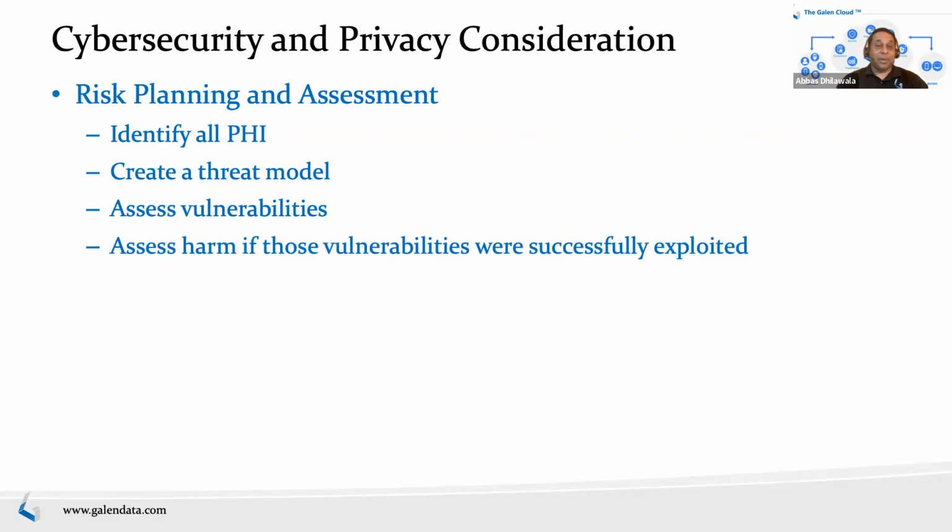And then you assess harm. What happens if those vulnerabilities are exploited? What's the harm to the patient? Again, very similar to safety risk, same process, same general risk assessment, and then assign a probability of such an event happening. Now the probability is only for priority. Probability shouldn't be used to completely discard those risks. It's just to identify what you should address first. Obviously, there are limited resources. Nobody has unlimited time and money. So there are always going to be certain risks that you accept, and you have to do your risk-benefit analysis at the end, just like you do with your safety risk. You do that with cybersecurity risk. But you want to assess probability.